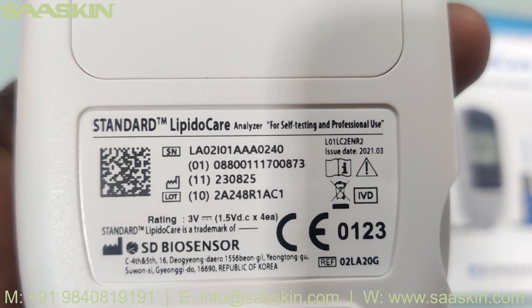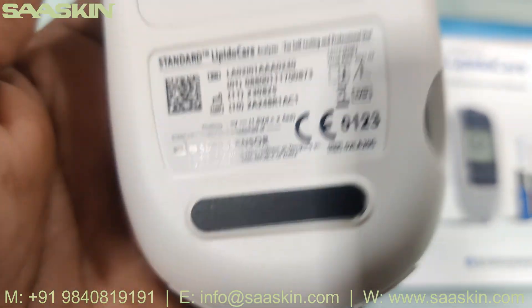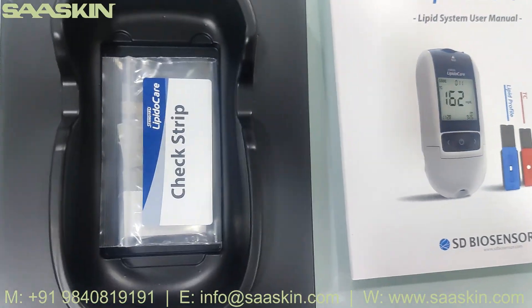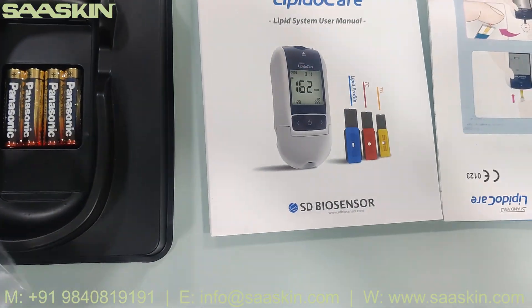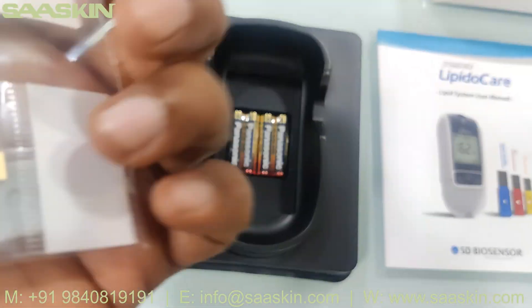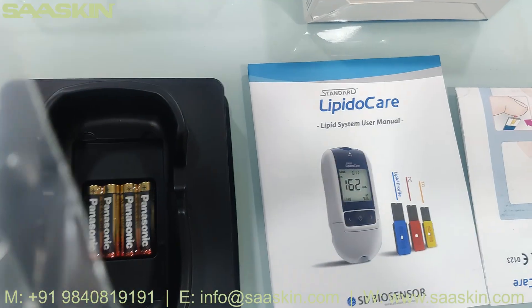You can see the product reference code and the lot number on the device. The battery compartment and power button are located here. Inside, you can see there are check strips included — here you can see the check strips.